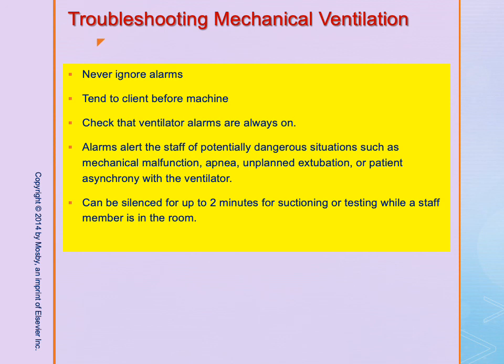Nurses in the ICU often experience what's called alarm fatigue. It gets to the point to where they hear so many alarms that it kind of gets drowned out, which is a very dangerous thing because it's kind of like your baby crying when parents sometimes get to a point to where the baby's crying, they don't even really hear it anymore. So you want to avoid alarm fatigue and just to be alert and aware and always check the patient first, then look.